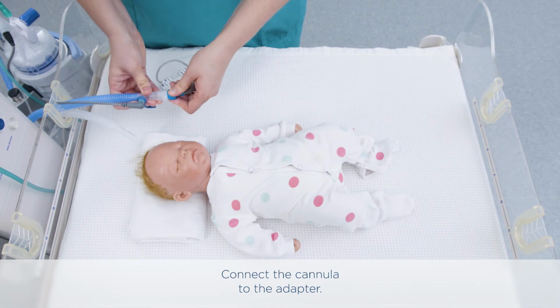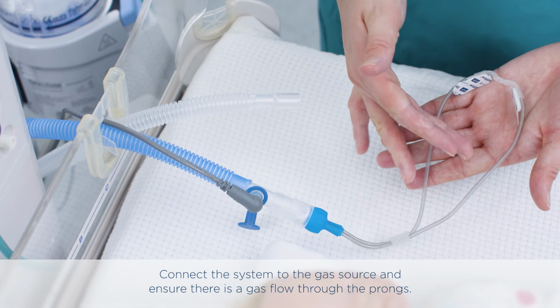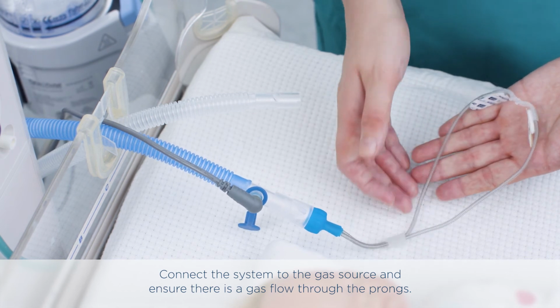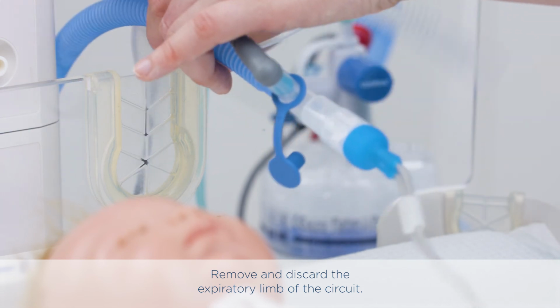Connect the cannula to the adapter. Connect the system to the gas source and ensure there is a gas flow through the prongs. Remove and discard the expiratory limb of the circuit.